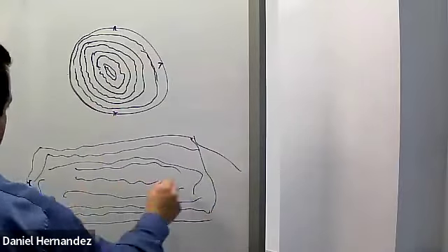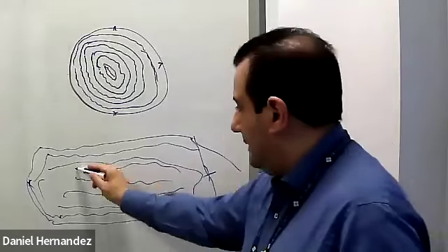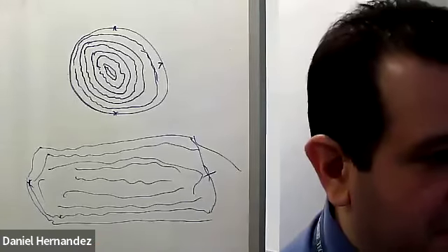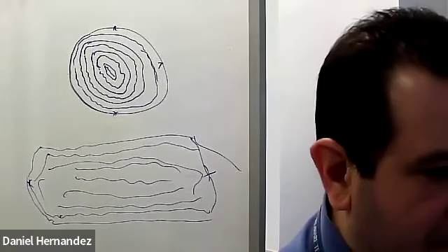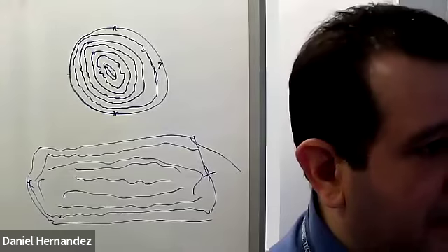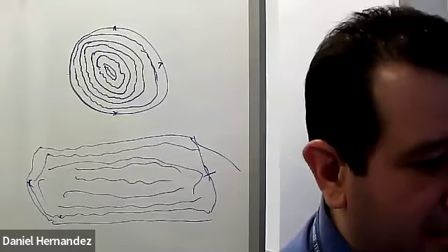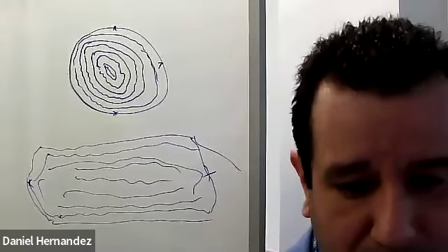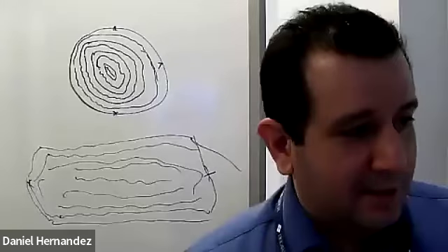They're going to want to know the length of it as well, how long that intussusception is. So this is the one that creates a pseudo kidney appearance. I think I got sag pictures here. Well, the textbook had a good sag picture of intussusception. Actually, I think I have it on D12. Let's see, stop share. And these are some nice intussusception pictures.